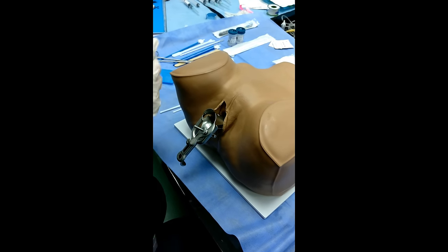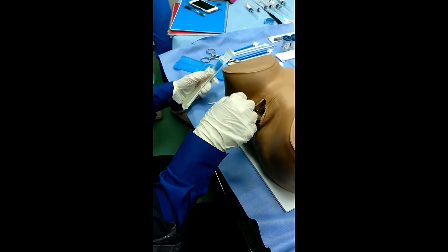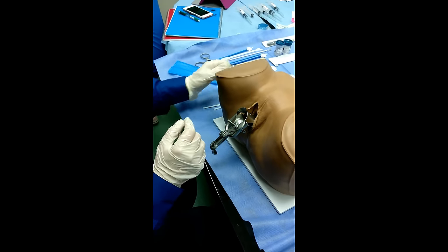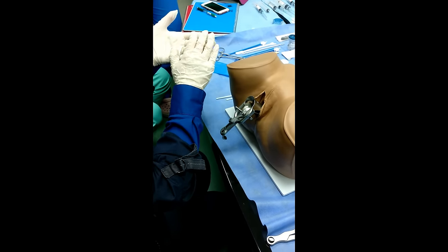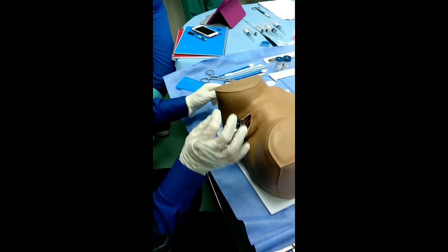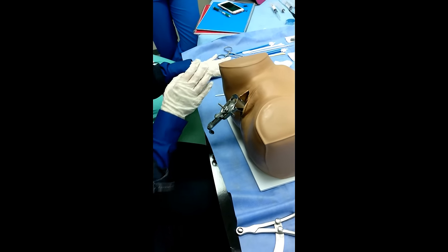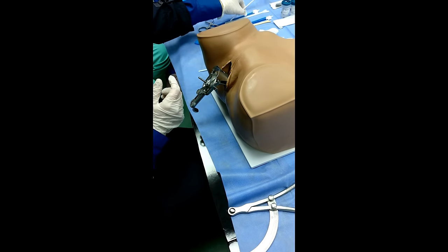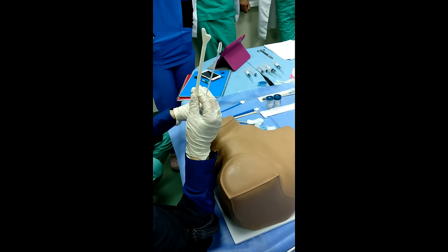In case of culture with the cotton, you collect from the posterior vaginal fornix and cervical canal, and you apply. Write the name, label the glasses, or label the probe with the name of the patient, the date, and the material collected. For conventional pap smear, it's the same. We put the speculum. For conventional pap smear, we use two instruments and two glasses.